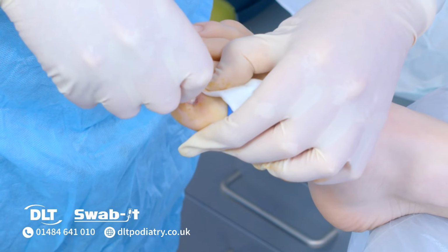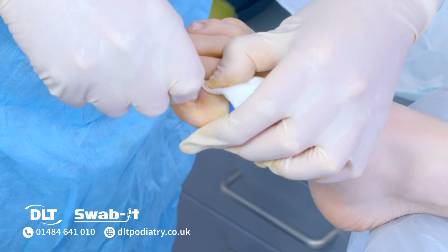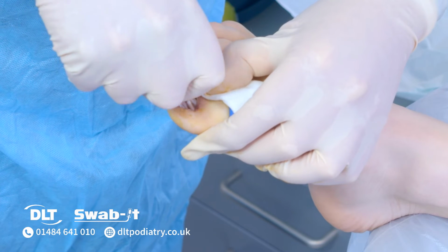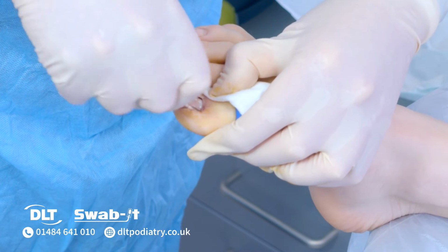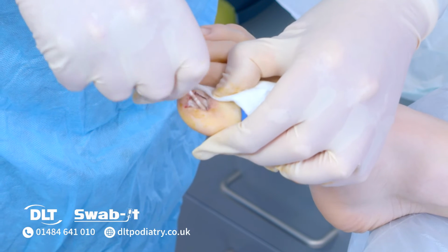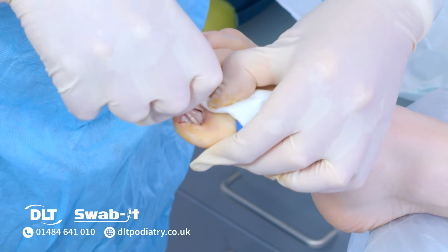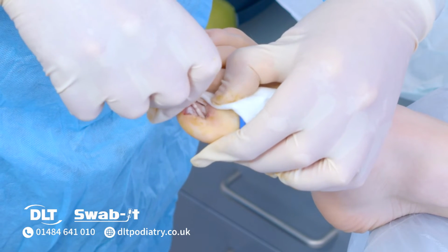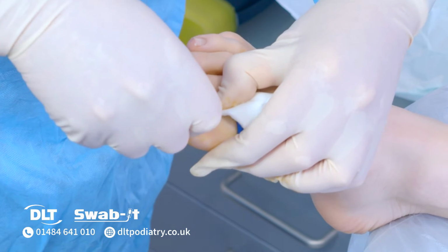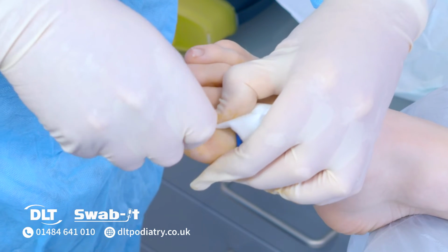And you know where the phenol has gone because, as you all know, it blanches the tissues, and you can see a clear blanching effect. And you can see me rotating, and you might be able to see all this phenol coming out, which is good. But this rotation is key to the success of using this product.